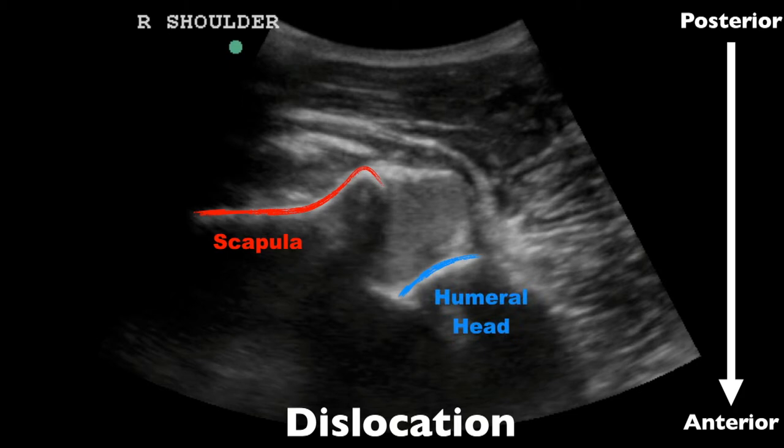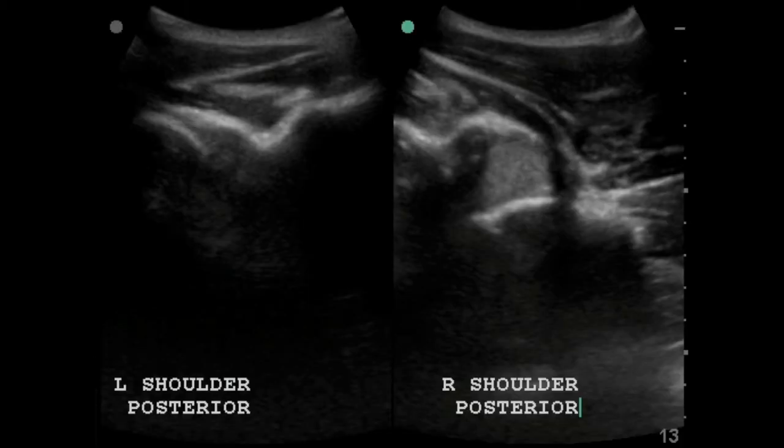If you notice, they're not up next to each other like we've seen in the other examples. Because this is posterior and this is anterior, this is an anterior dislocation of the humeral head. If it were posterior, it would come closer to us. This white area that we see here is a hemarthrosis.